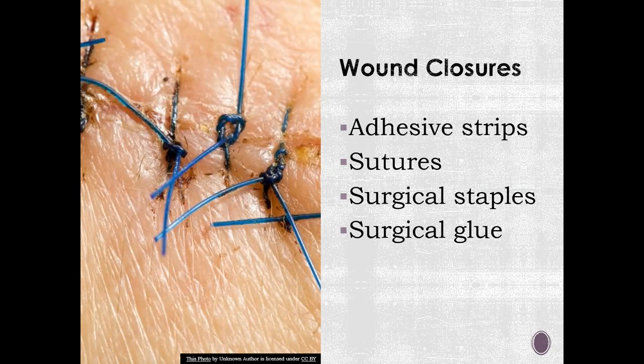And we close the skin on the wound that has been closed subcutaneously to aid in the reducing of scarring. It gives additional support to the wound after sutures or staples have been removed. The adhesive strips are often kept in place until they begin to separate from the skin on their own.